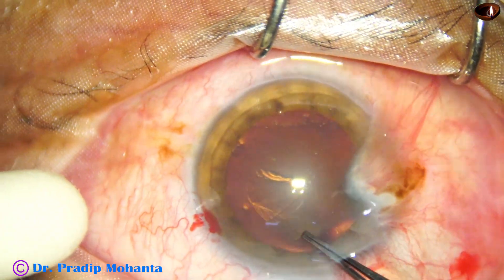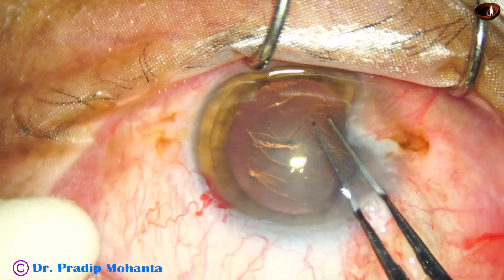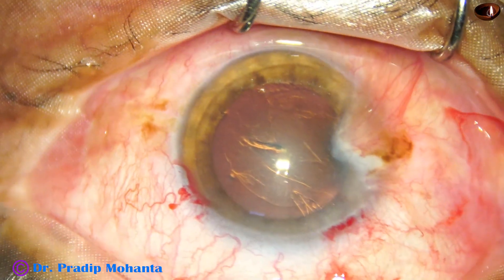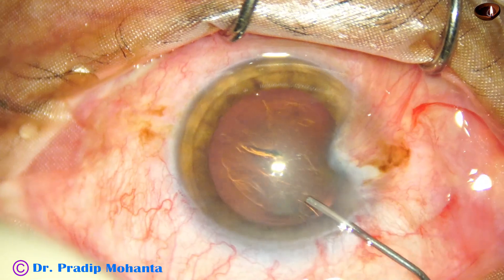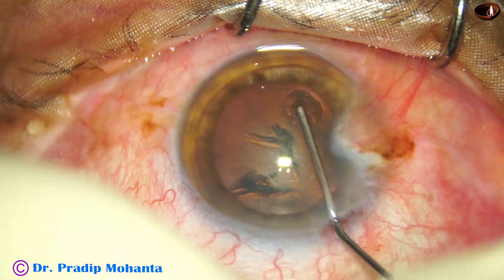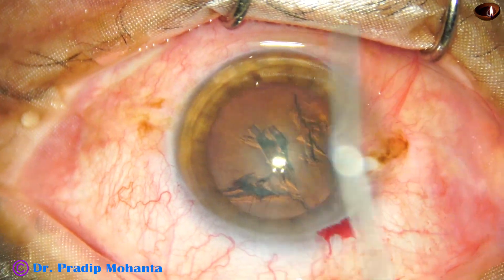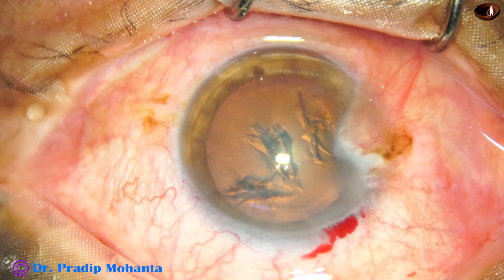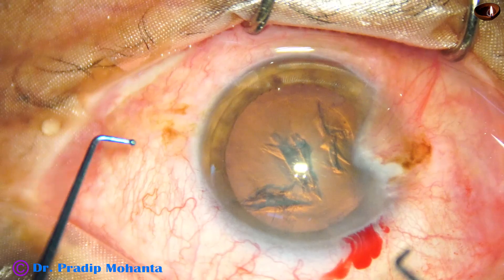Now capsulorhexis is being done with the help of utrata forceps — I do the movements anti-clockwise. Now hydrodissection using BSS and a 27 gauge cannula. Visco again, and now I am using the long nucleus sustainer that I designed recently.